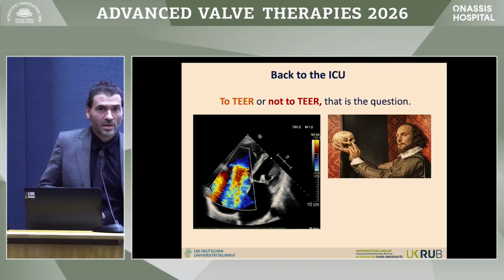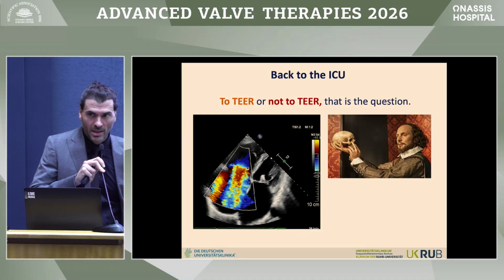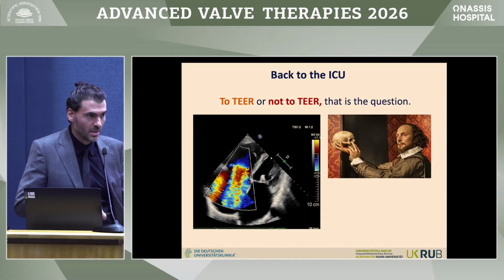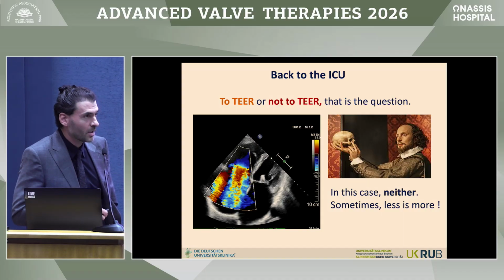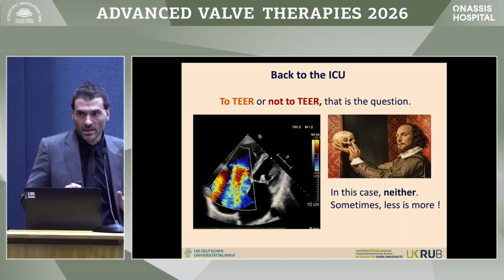So we're getting back to the ICU patient. I hope that everybody's sitting and has their bottle up. We're going to take off. What did we do with this patient, to TEER or not to TEER? We did real magic. We didn't do anything at all because we didn't have any chance to do anything reasonable.